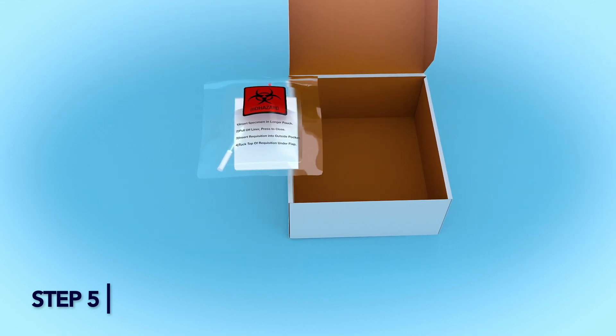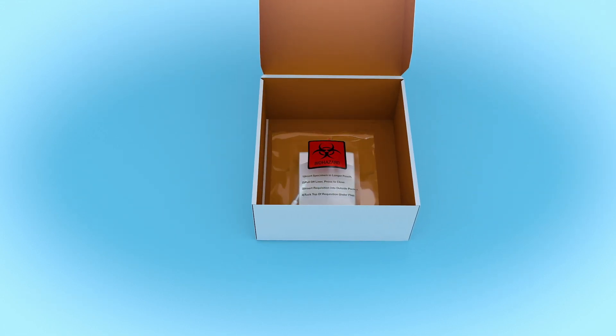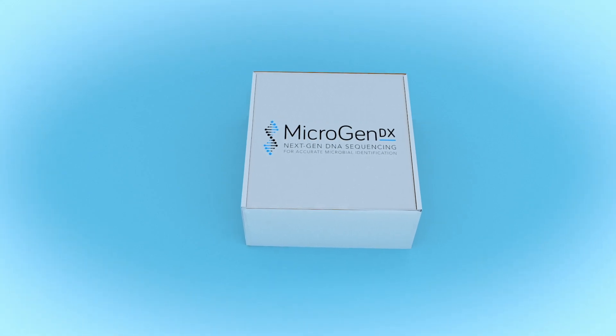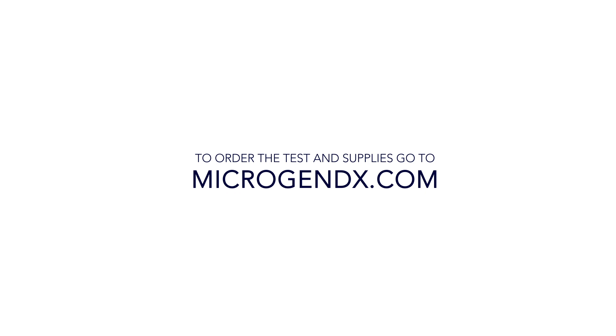Place the sealed bio bag into the MicrogenDX prepaid shipping box and send out according to your facility protocol. Alternatively, take it to the nearest FedEx Dropbox. To order the test and supplies, go to microgendx.com.